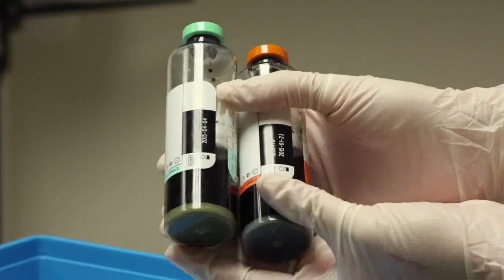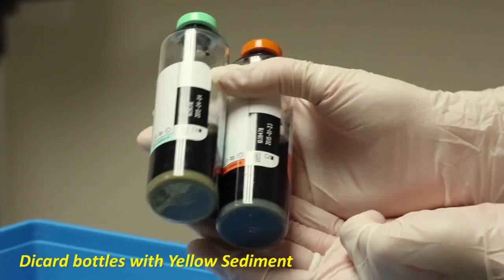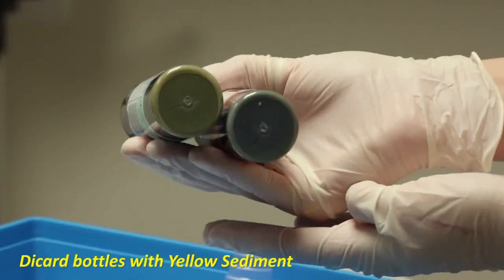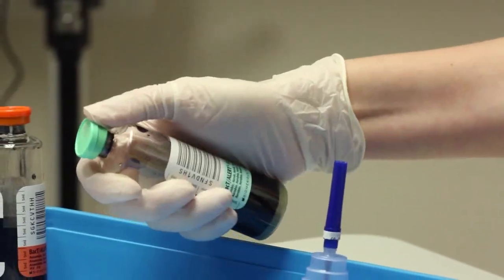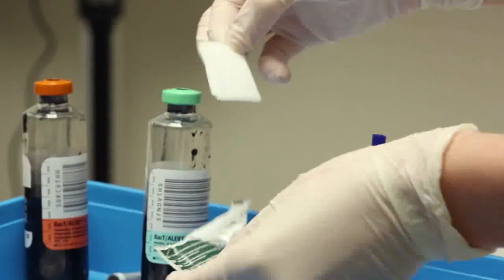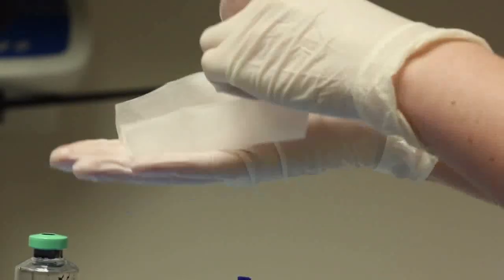Check the expiry date on the blood culture bottles and make sure that the sediment at the base of the bottle hasn't turned yellow. Remove the seal from the blood culture bottles and fully open a chlorhexidine wipe and lay it onto the palm of one hand.